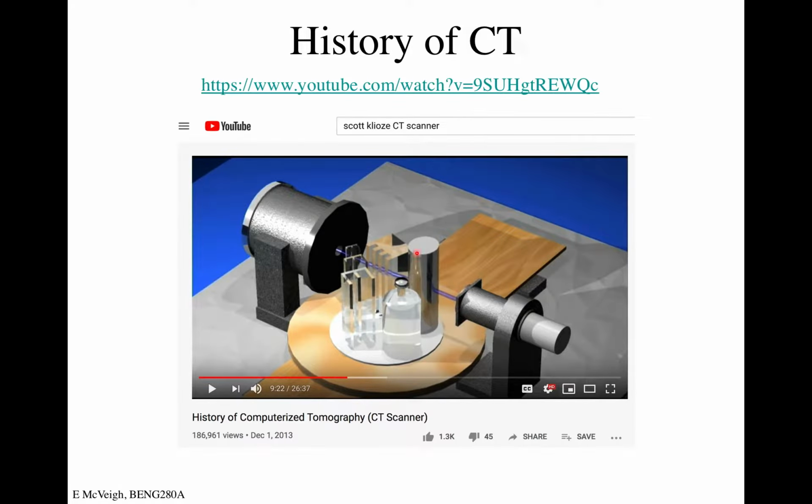And this is his original experimental device that he built at EMI with used parts around the lab. This is actually not an X-ray source. Inside this can is a radioactive substance that is just shooting out gamma rays and X-rays and all sorts of radiation. But he put a pinhole right here so that radiation was shooting out a hole right along here. And then this is a sodium iodide crystal that you use for nuclear physics experiments. Like when a high energy photon hits it, you get a flash. And then he counted the clicks as it came through here.